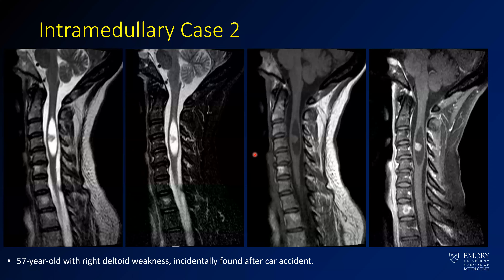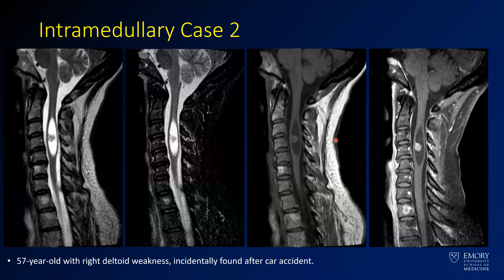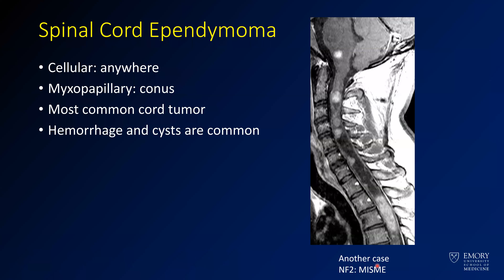Here we have a counter case — a 57-year-old with right deltoid weakness. They were in a car accident, got a CT to evaluate for trauma, and this lesion was found incidentally. Similar to the other lesion, the cord is expanded, but the margins are a little better defined. On T2 and T2 fat sat, you see pretty well-defined margins with what looks like a little nodule in the center. On post-contrast, that little nodule in the center is enhancing — this is an ependymoma.